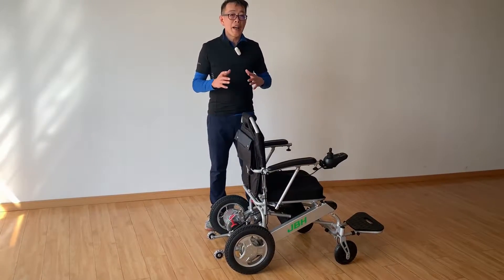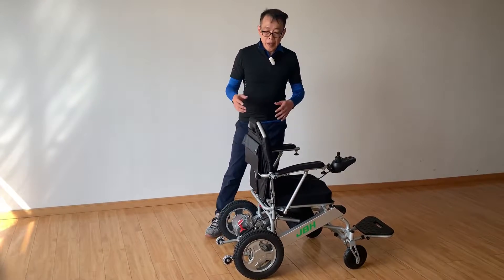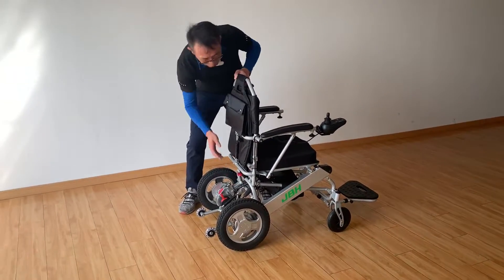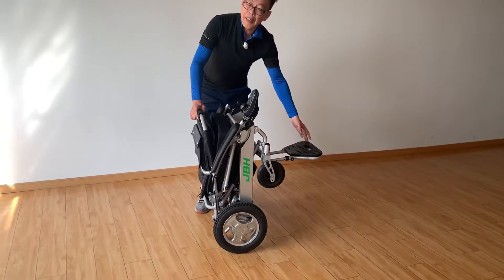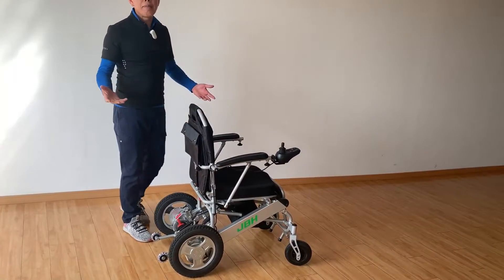Let me show you how easy, convenient, and quick we can fold the wheelchair. First, you just touch the button here, push it down, then fold it — one second. Simply push it down and up. That's it. Thank you very much.